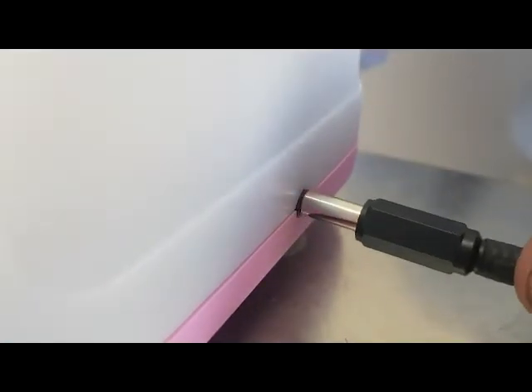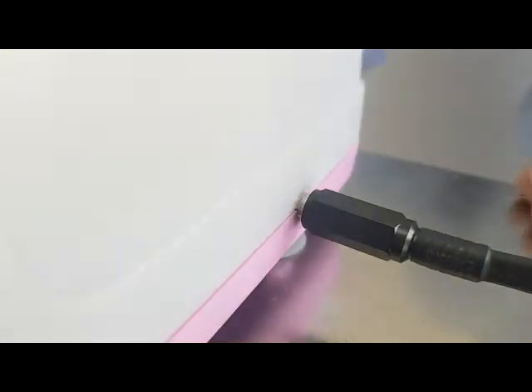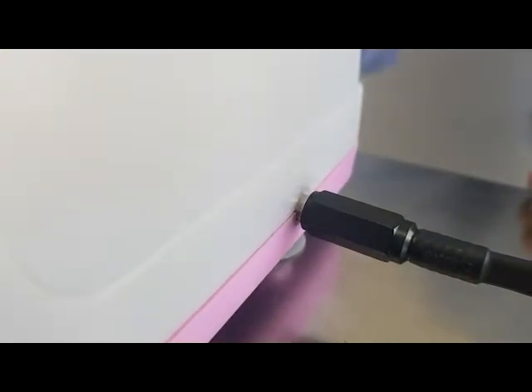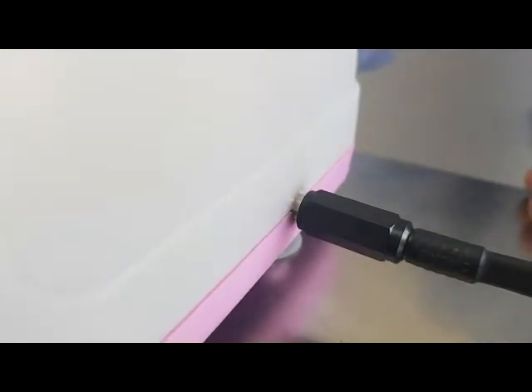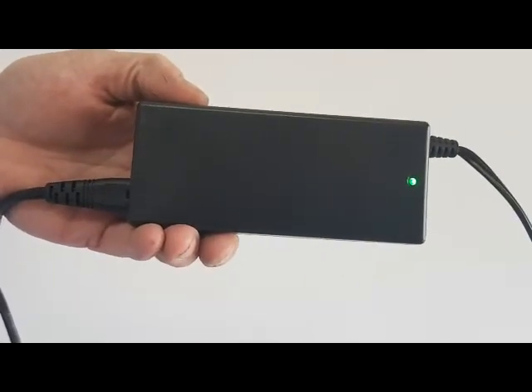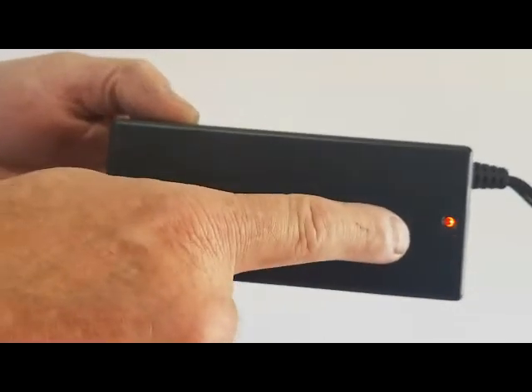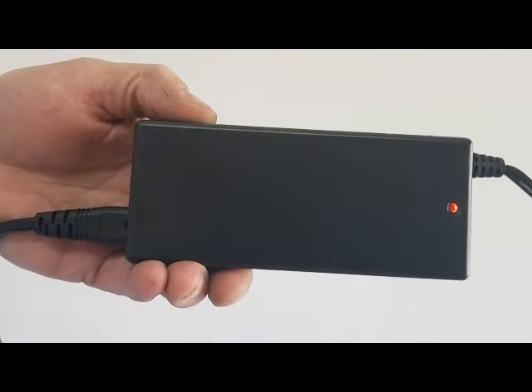When plugging the charger into the Genie, please note that the plug must be inserted fully into the Genie Pill Crusher. Once you plug the charger into the Genie, you will then notice that the green light on the charger will turn red. That means that the Genie Pill Crusher is charging.